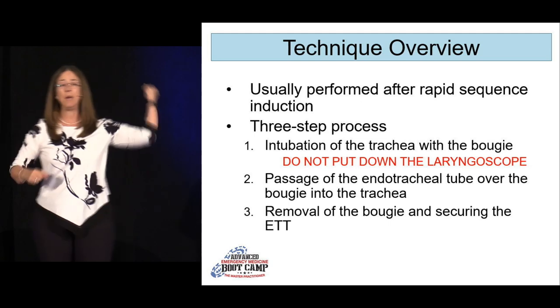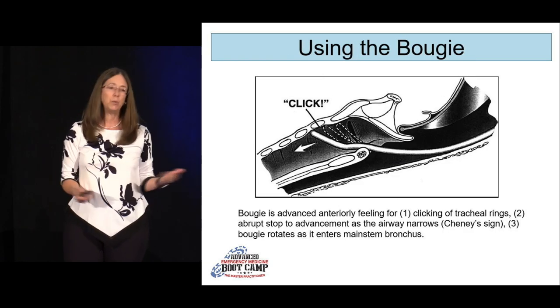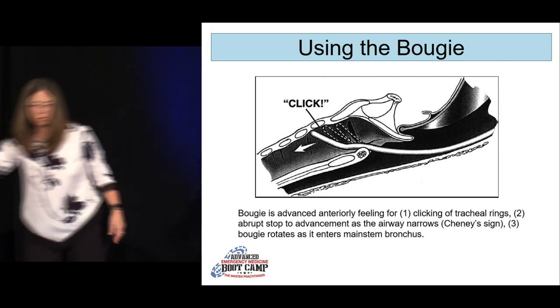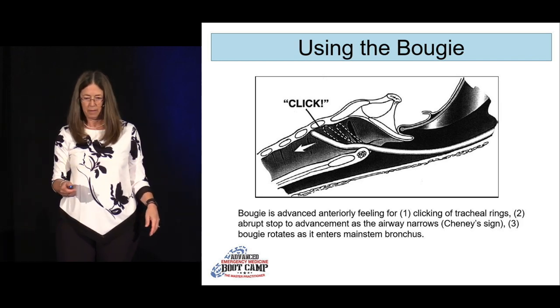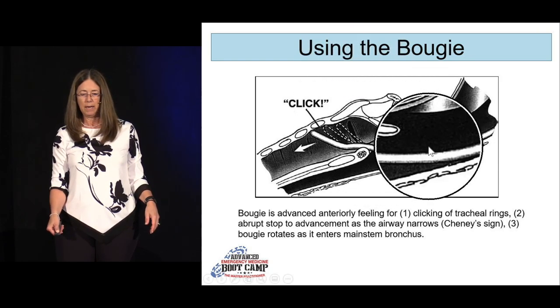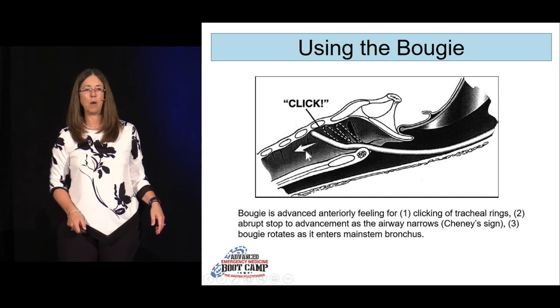So you can then just grab the endotracheal tube and watch it go in. The reason for that is if you take that out, so let me show you a pic. So here's what it's doing. It's slipping down beyond this thing. I think I can use this, actually. Let me see if this works. Oops, nope. There we go. Okay, so there's the epiglottis. It's slipping past the epiglottis and down into the airway.